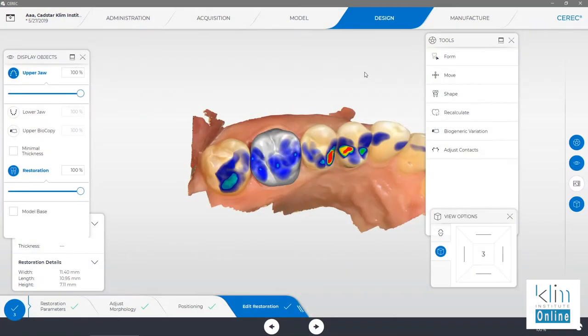That is the bread and butter for posterior restoration — so my restoration just drops down, the margins are on, the interproximal contacts are spot-on, and I don't have to adjust the occlusion in. Let's go ahead and get started. Let's review the flow in the design screen when we're doing a single posterior restoration. Several things I want to be aware of to set it up right.